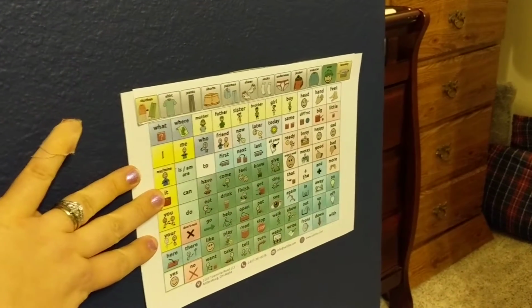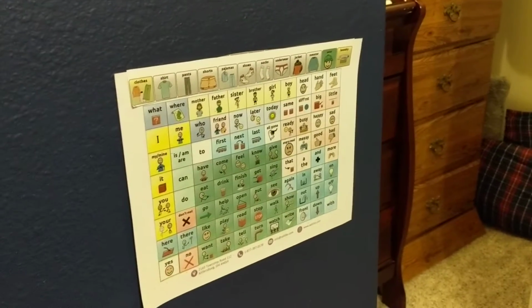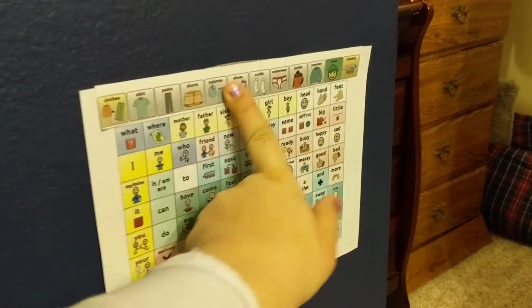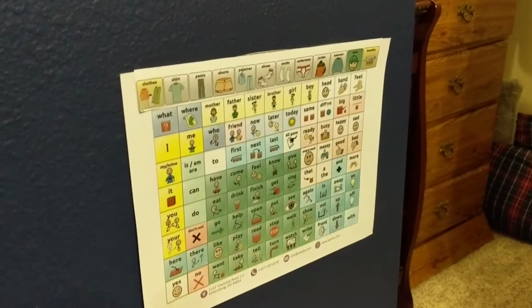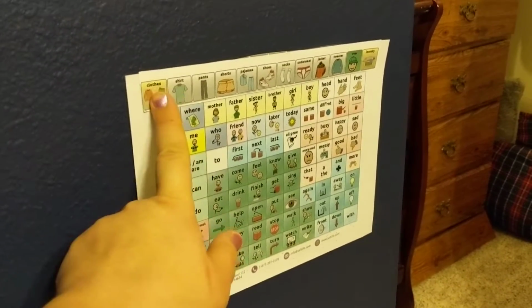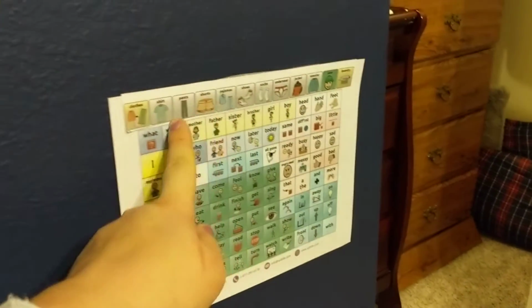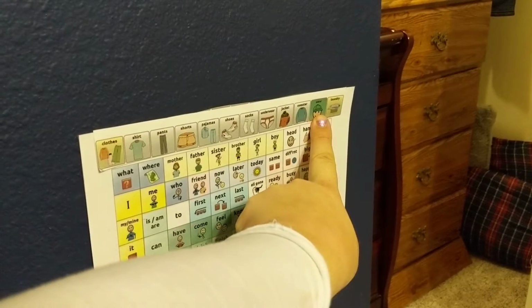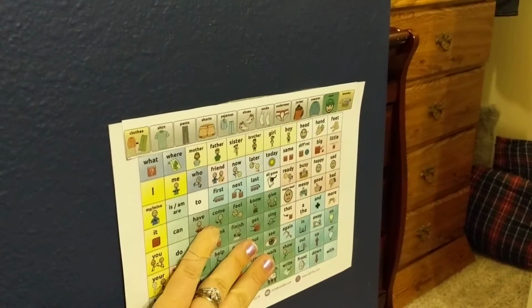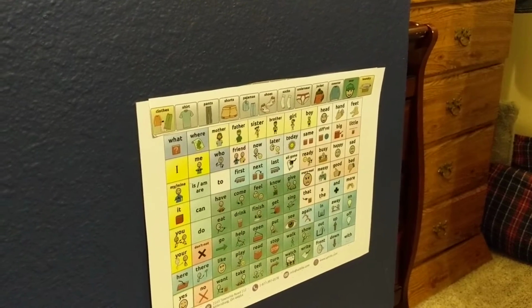So I just have the Tell Me board, manual communication board here, and then at the top, like I said, I used that capture feature within Chat Editor, and I went to the clothing section and just got some nouns up here. So I have my fringe plus an additional core word with the wear, since that's not on my main board. And so we have used this a lot.